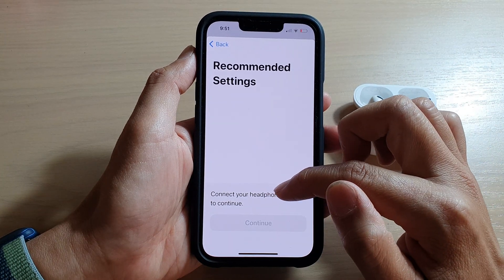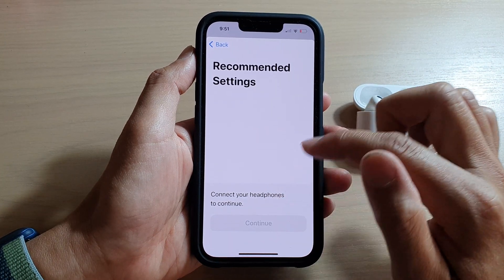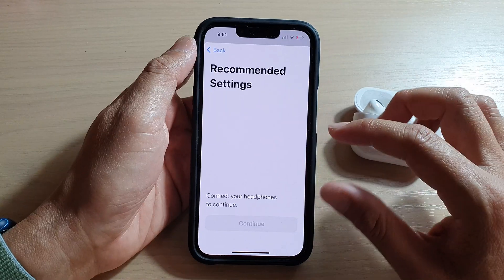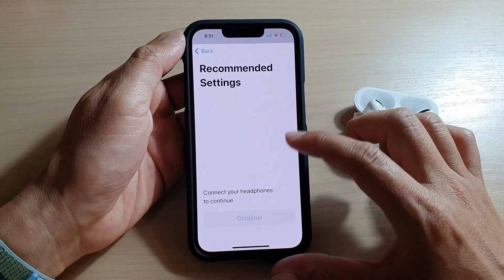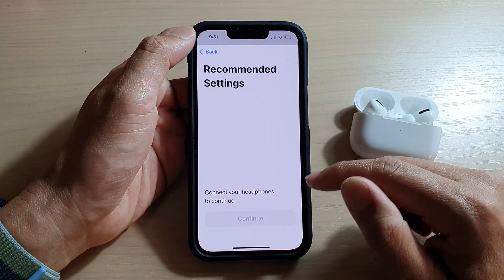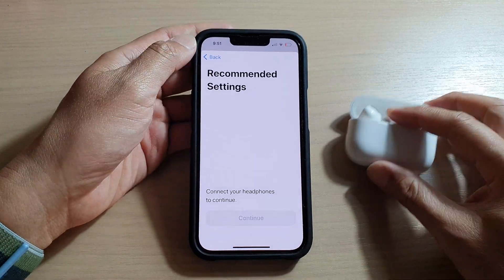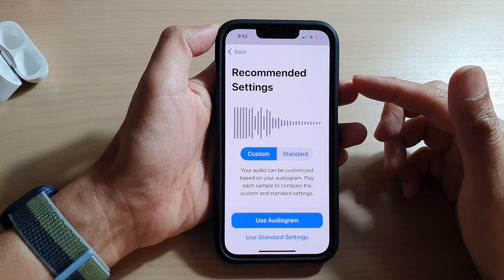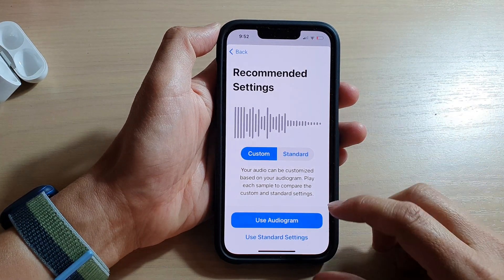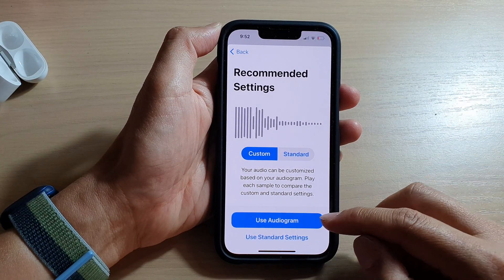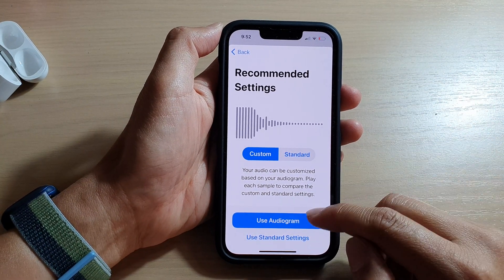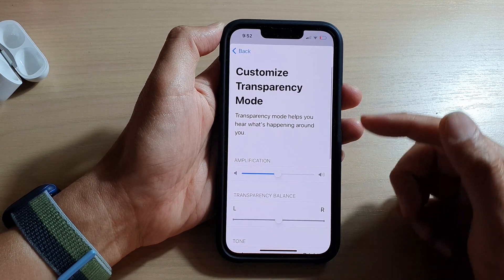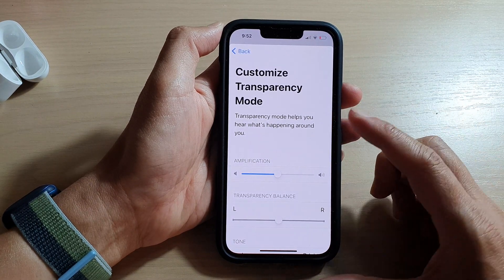Now it says connect your headphones to continue — this is to proceed with setting up your Apple headphones. Once the headphone is connected, you can then choose Audiogram.